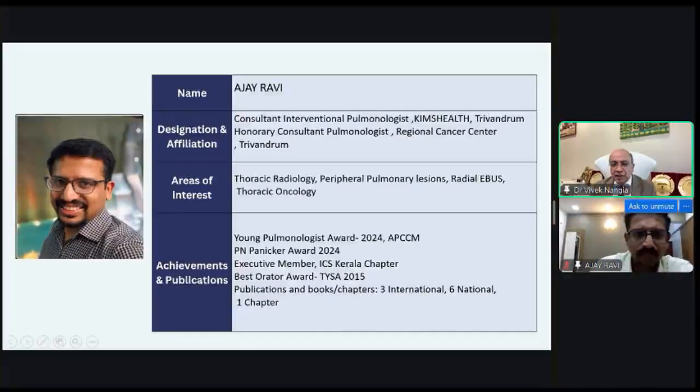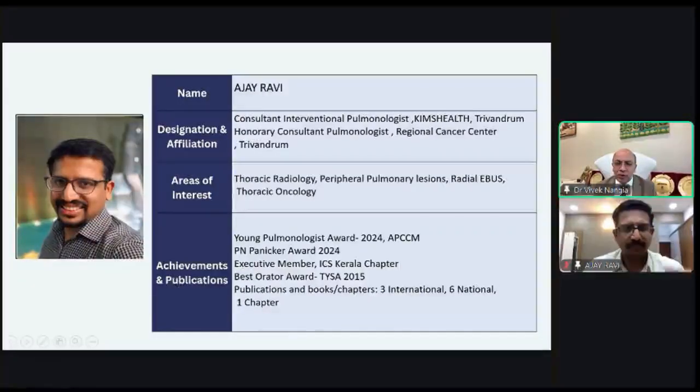Initially, when we started our practice, there always used to be just a bronchoscopy and BAL, and that's the end of it. But now we realize that even the smaller peripheral nodules can be accessed easily with the help of navigational techniques, with which you can actually get to a diagnosis in no time. In fact, there are recent studies talking about moving away from CT guided biopsies to transbronchial biopsies when it comes to diagnosing and identifying cancer.